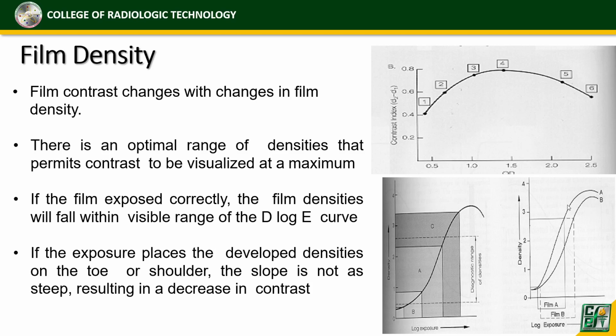Okay, so i-discuss natin na. Kung makikita nyo dito, okay, so this one is the sensitometric curve or the D-log E curve. Okay, so the visible range, okay, ang visible range ay yung straight line niya. Visible range. Okay? Visible range siya ng D-log E curve.